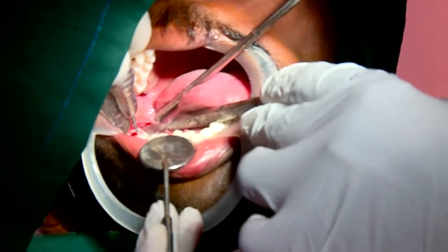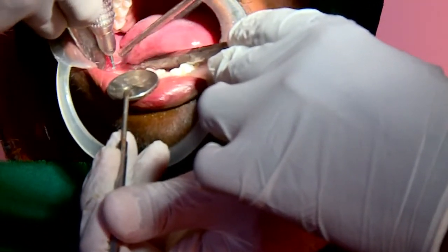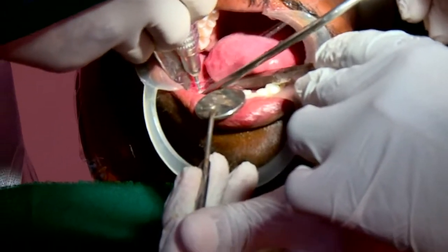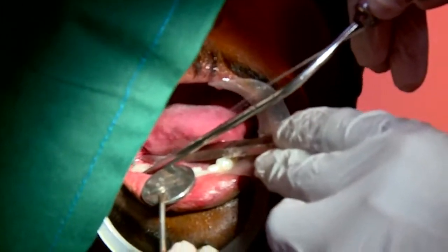When you split, the top portion of the tooth, or the crown that sir is splitting, will be slightly larger than the lower portion of the tooth. Why is that? Because if the bottom of the crown is larger than the top, the crown will get stuck.